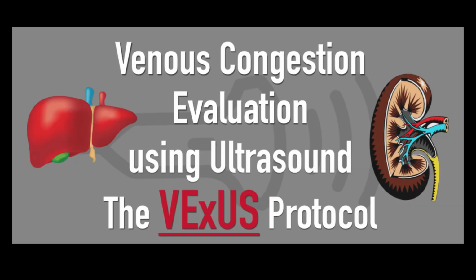Okay, we're quickly going to talk about VExUS. The idea behind this is, when is your patient getting edematous? By the time you find that the patient looks a lot different to yesterday, when he was quite nice and thin and now everything's edematous, by that time you probably don't need to think too hard that the kidneys, the liver, the gut, the lungs, everything is going to be edematous.